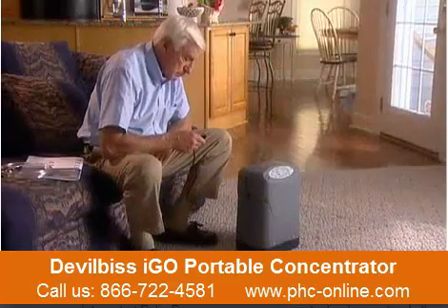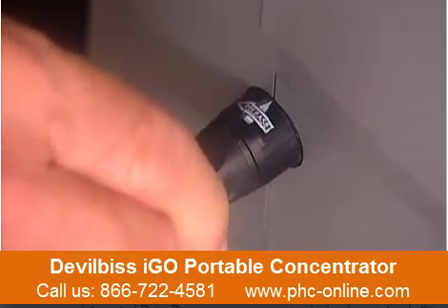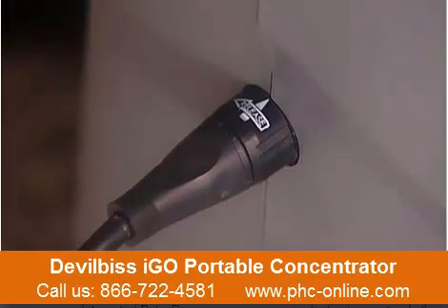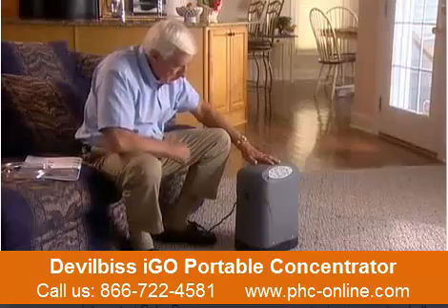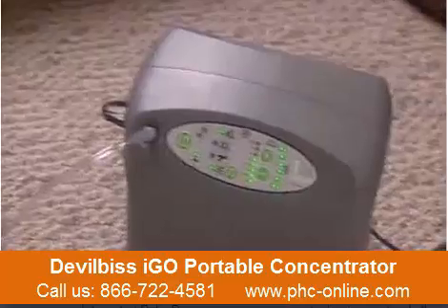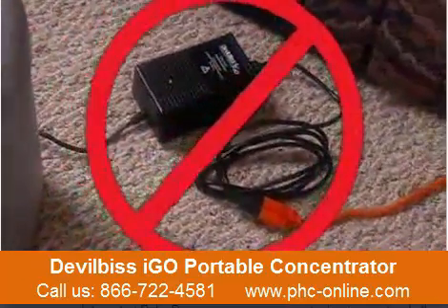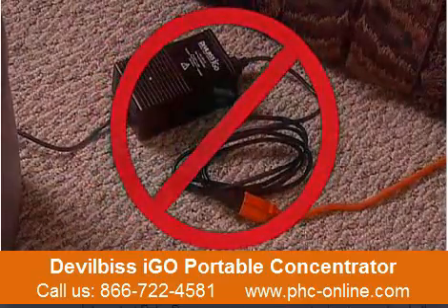To connect the AC adapter, align the arrow on the plug locking ring with the arrow on the receptacle of the unit. Push until the locking ring twists slightly counterclockwise, then snaps back into alignment with the arrow on the receptacle. To disconnect, grasp the plug, twist counterclockwise, and pull. Remember, never connect your iGo system to an extension cord or electrical outlet controlled by a wall switch.